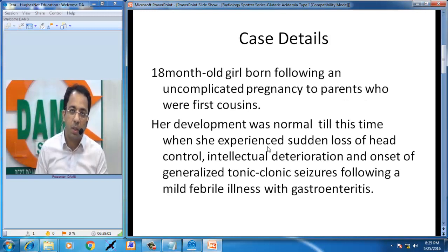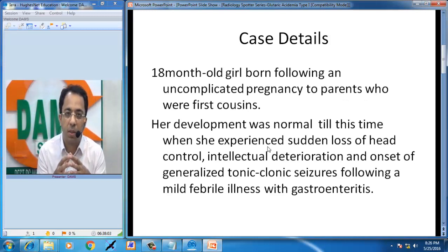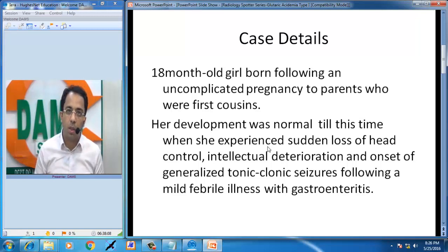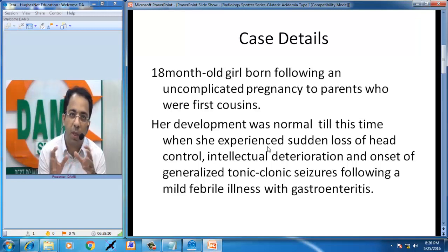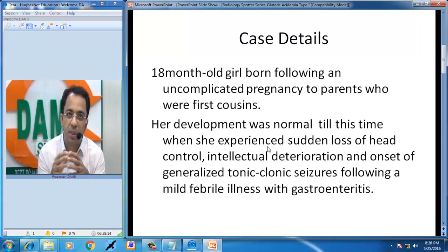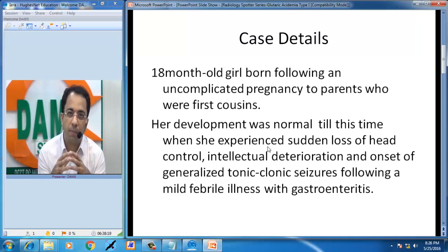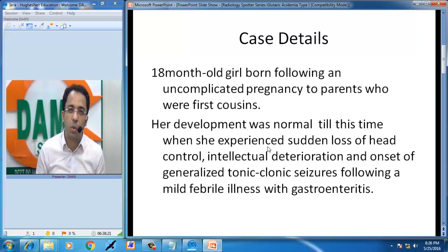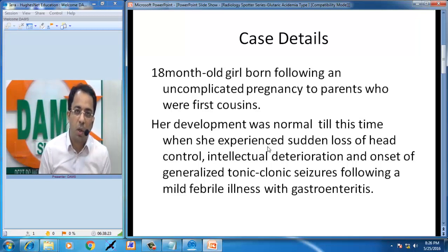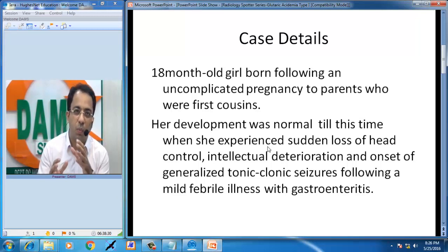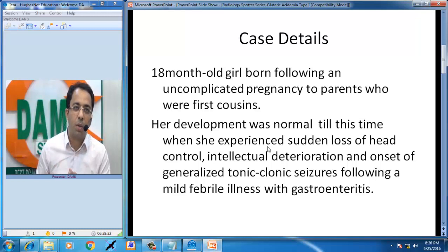This is the history of the patient. I will show you the MRI brain of an 18-month-old girl, born out of an uncomplicated pregnancy to parents who are first cousins — which is very important to realize. Development was normal till this time, then she had sudden loss of head control, intellectual deterioration, and onset of generalized tonic-clonic seizures following a mild febrile illness with gastroenteritis.